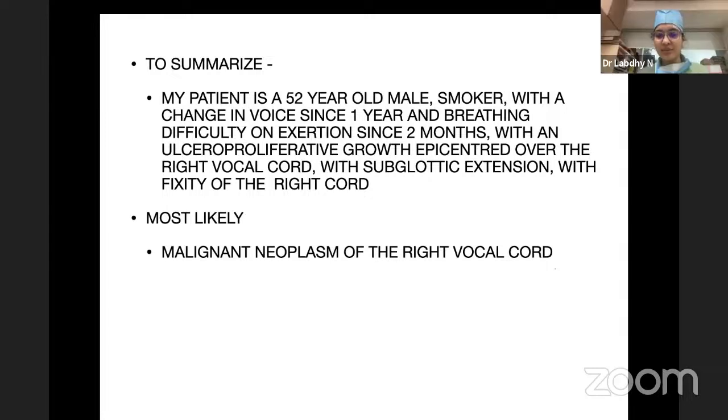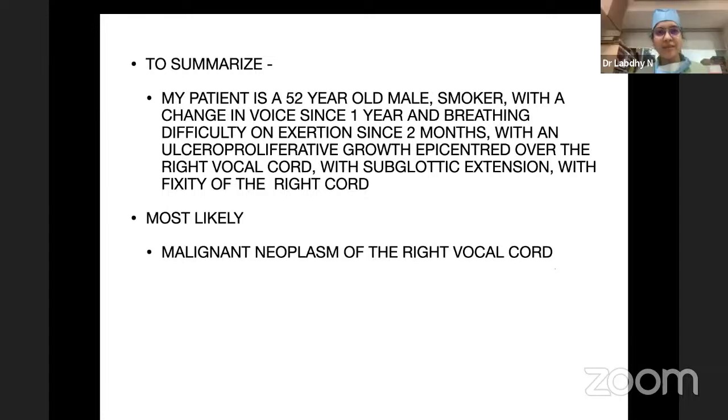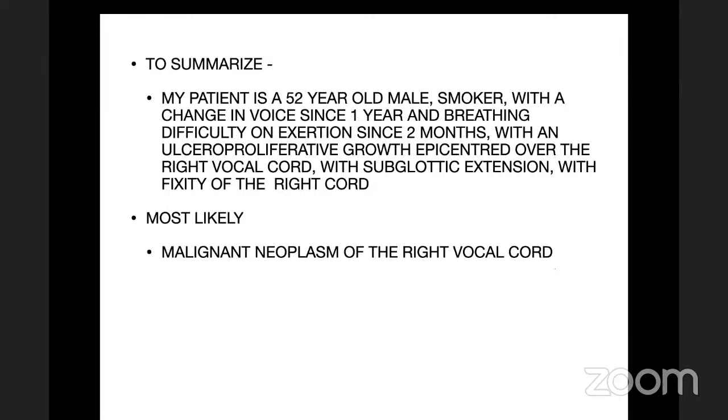Sclerosis is the most sensitive. And most specific? Most specific is erosion, lysis, and transcartilaginous spread. I'm asking for one. Most specific: the transcartilaginous spread. But what is the problem with the extralaryngeal spread?